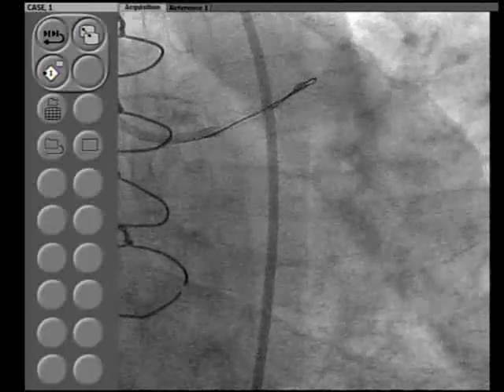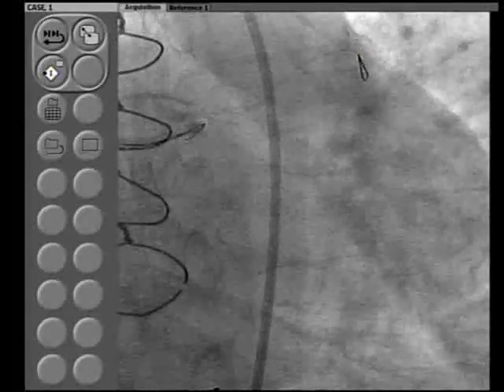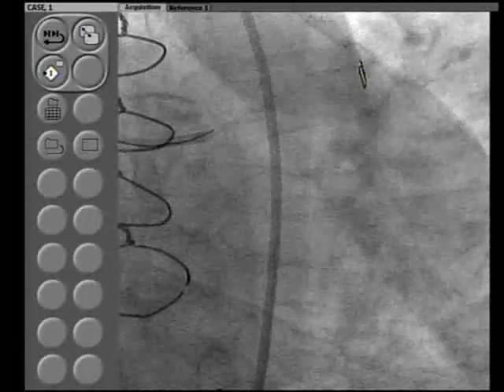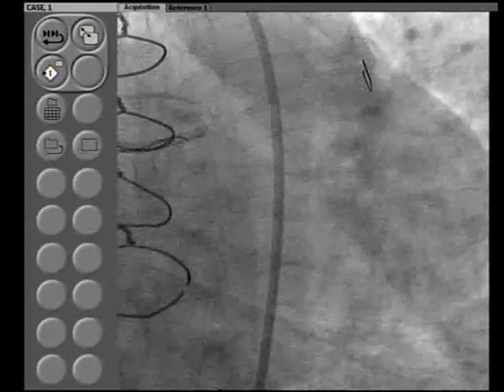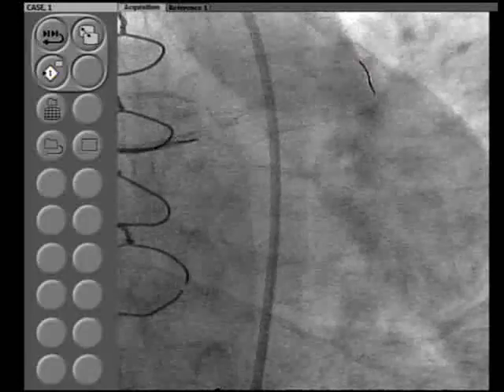I'm sure Anu must have been surprised that we are doing the IVUS, because usually from our point of view, this case is done. But today is the IVUS, so that we need to show, based on the IVUS, whether we need to get some further expansion, or we are truly done angiographically.